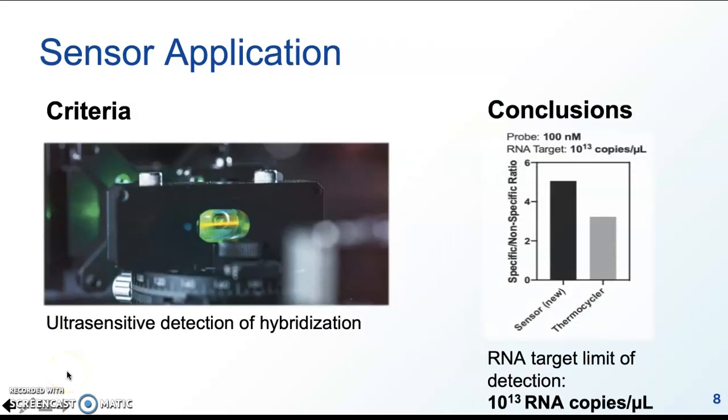Our waveguide-based optical biosensor was originally designed for bacterial diagnostics, but our project was the first to employ viral diagnostics on the sensor. To make our molecular beacons compatible with the sensor, we conjugated the beacon to biotin, which would not interrupt the beacon's binding mechanism to the synthetic target. The surface of the waveguide is coated with streptavidin, and because we know the streptavidin biotin proteins tightly bind together, we can ensure that the beacon is anchored to the waveguide surface for analysis.